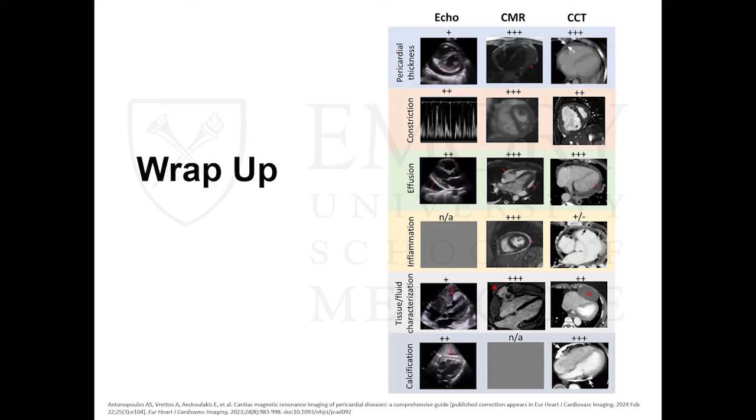Okay, well, great talk, great review, and just another tool in our toolkit for what is often a very difficult and tricky diagnosis. The key again with suspected pericardial constriction is to use all the tools you can on these folks, be it invasive hemodynamics, echo, MRI, and even CT, to fully assess, make the diagnosis, and fully assess everything else that may be going on.